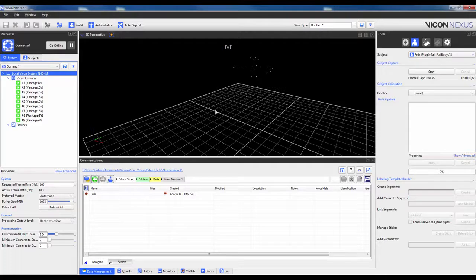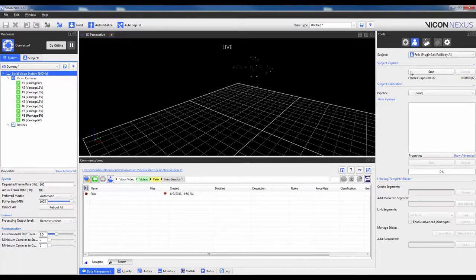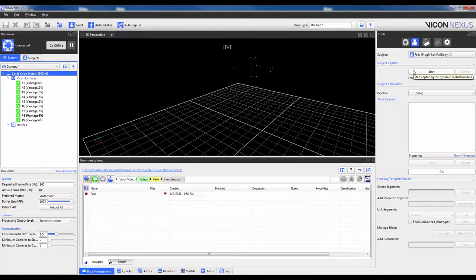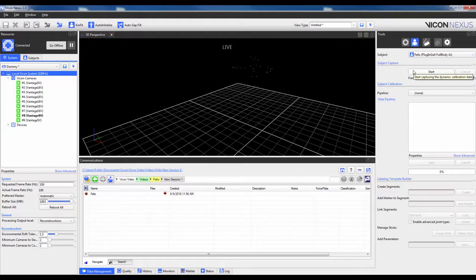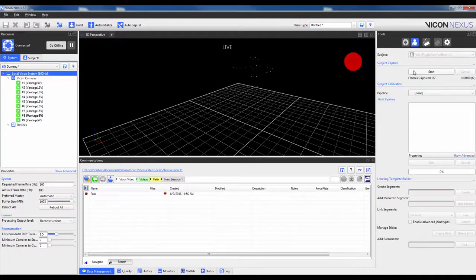Then when you are confident all the markers are there, go ahead and click Start. The subject will need to remain as stationary as possible during capture. You only really need one frame of acceptable data, so I will make this about one second long.